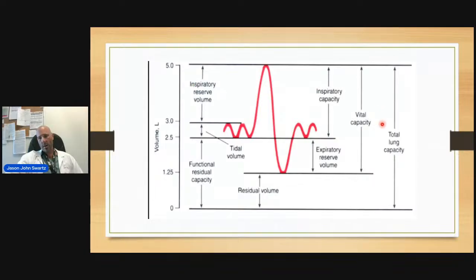In our intensive care, when we have some of the more tricky patients to ventilate, we'll use electrical impedance tomography, the Pulmovista 500. We'll do an optimal PEEP, and if we don't get what we want with conventional modes and an optimal PEEP, perhaps it's just not recruitable because it's lacking the time, then we'll keep the monitor on and we'll see if APRV improves things.